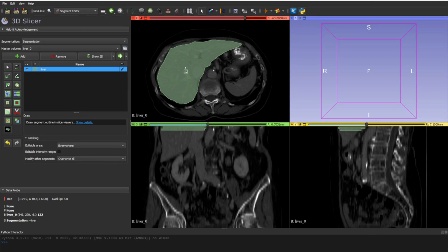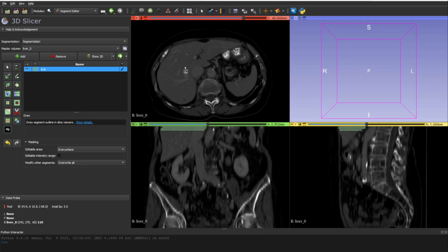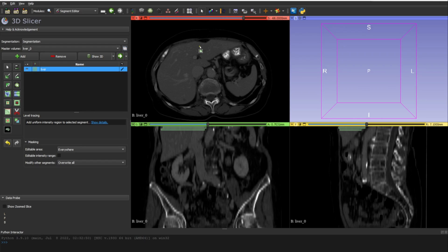So we now have our first slice done with the brush, and the second slice done with the polygon tool. Let's move to the third tool. This tool is similar in principle to the SAM (Segment Anything Model) — I'm not saying Slicer is as powerful as SAM, but the idea is similar: you scroll or move your mouse until you get the best selection for the region you want.